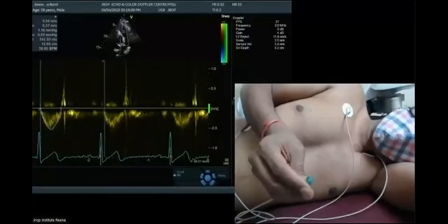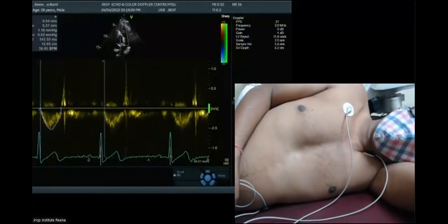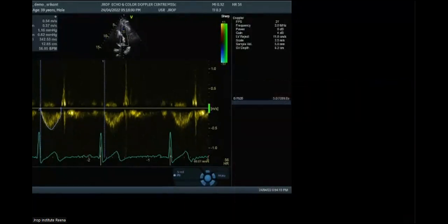We can get approximate velocities, but not true velocities. Okay, sir. But is it authentic to report it in subcostal view if you get approximate velocity? The idea in subcostal view should be to make your image as parallel as possible to flow. All right. Okay.